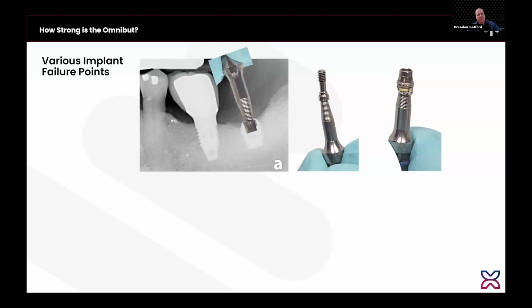I break the retention force on that component, and then the fragment comes right out. A stripped screw, an extractor tool is very easy to use to remove that stripped screw. An abutment fragment in the implant, use an extractor tool to pull that out.